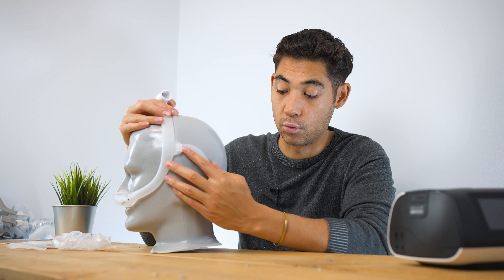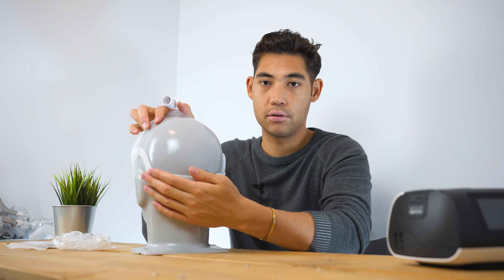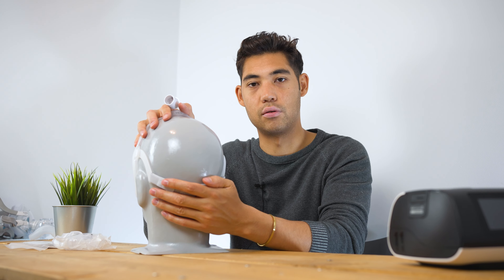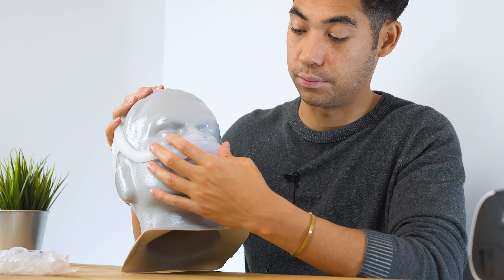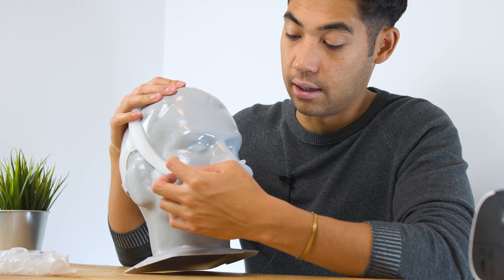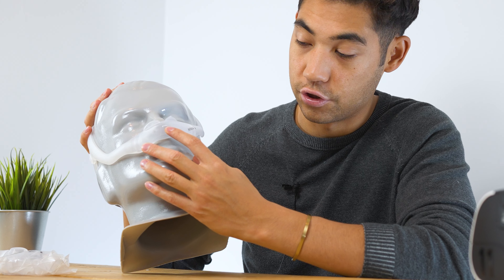There's no real quick connect with this mask — it just kind of takes off, so if you have to go to the washroom you'll probably just take off your mask. It's such a minimal mask that's probably easiest. This piece does come out pretty easily for washing, which is a nice little thing. And then we have some exhalation ports up there for all the air that you expire, and I think there's a little dot right there that air flows out of as well.